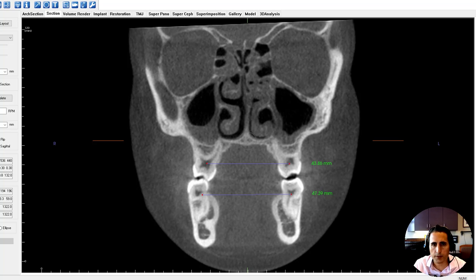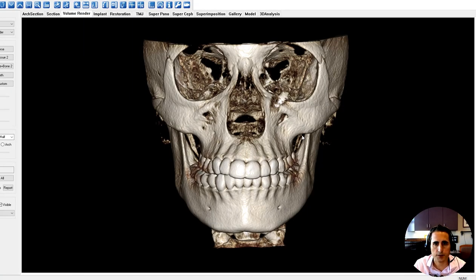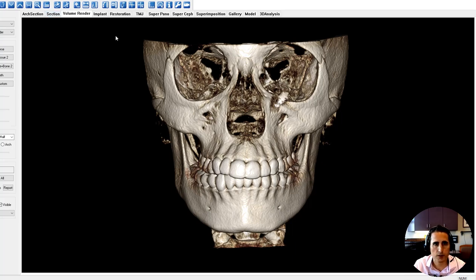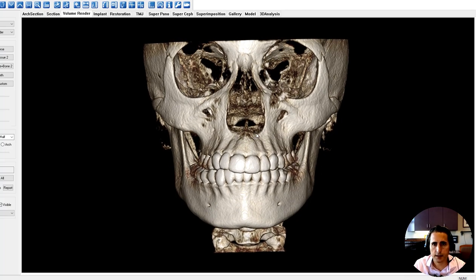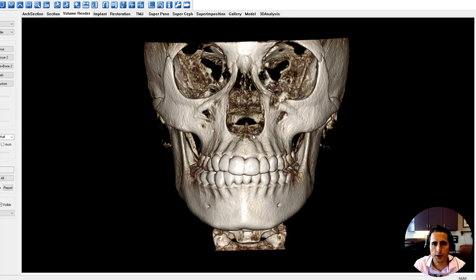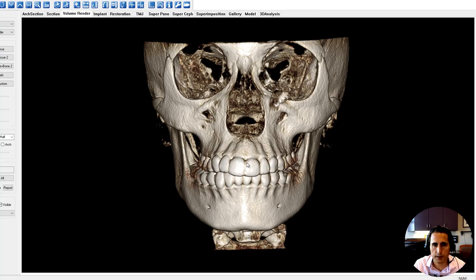One thing we'll look at is the actual skeleton on the cone beam. We've oriented this cone beam the way that most radiologists do — something I picked up from Dania to Mimi. We orient the cone beam based on the eardrums because that's the most reliable landmark. Once that's done, it gives us an idea of where this skull actually is. You can see that the left side of the skull is more inferior to the right side, which is consistent with what we're seeing with the incisors, but not really what we're seeing with her smile.